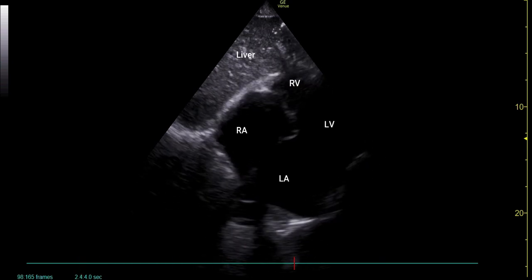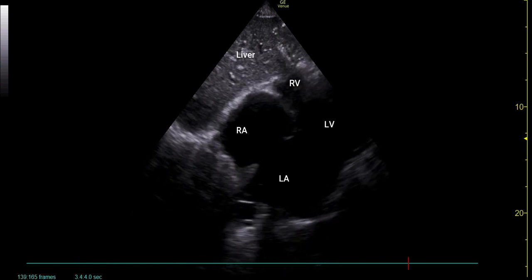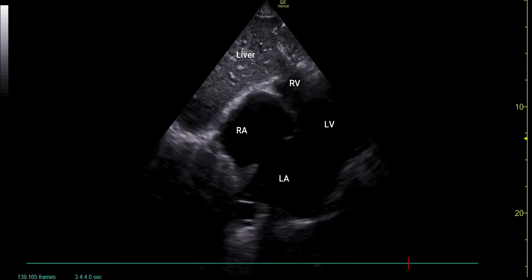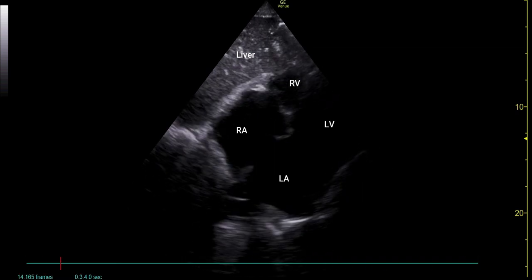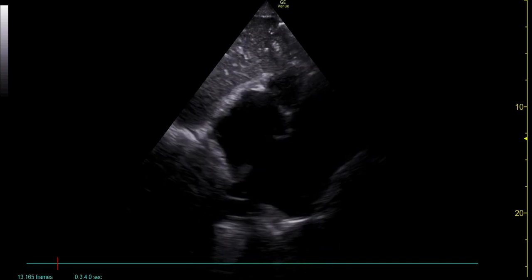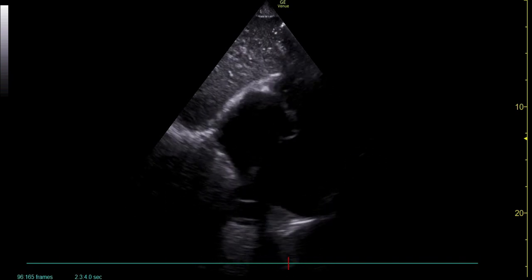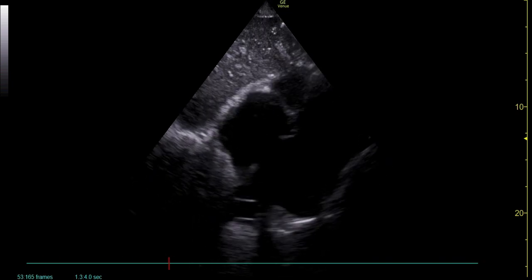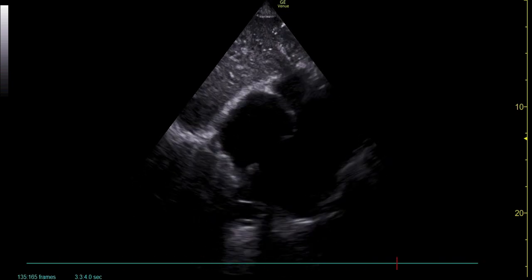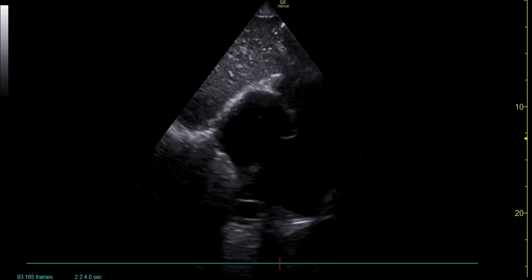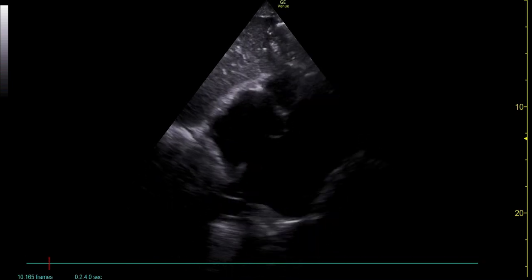In this video, taken from a patient in cardiac arrest, we can answer our three POCUS questions. Firstly, cardiac activity is present, however the patient had no pulse during the rhythm check — this is therefore pseudo-PEA. Secondly, there is no pericardial effusion, therefore we know that the cause of the arrest is not cardiac tamponade. Thirdly, the right ventricle is not enlarged, making a massive pulmonary embolism less likely as the cause of the arrest.